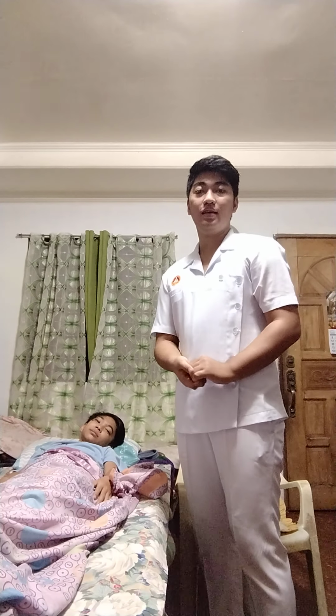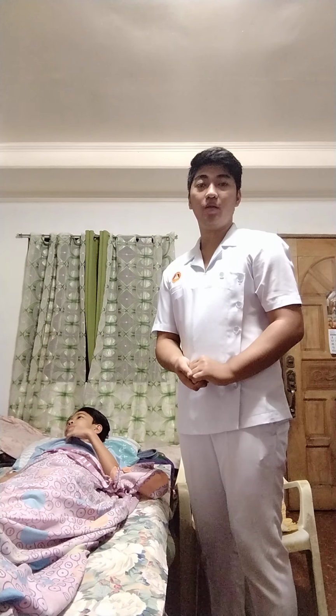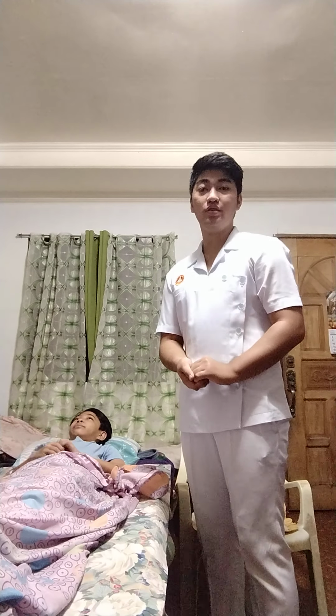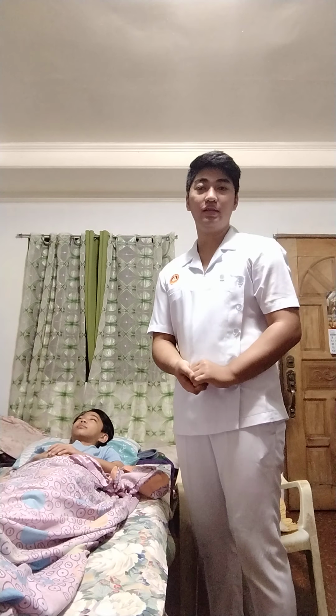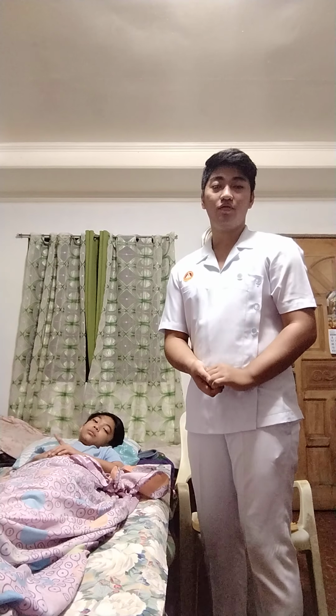And next, encourage the patient to make use of a stand assist aid, either freestanding or attached to the side of the bed, to move to the side of the bed and to a side lying position, facing the side of the bed on which the patient will sit. Lower the side rail and stand near the patient's hips with your legs shoulder width apart and with one foot near the head of the bed and slightly in front of the other foot.